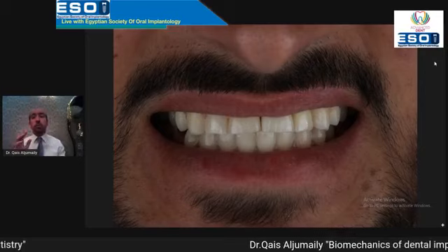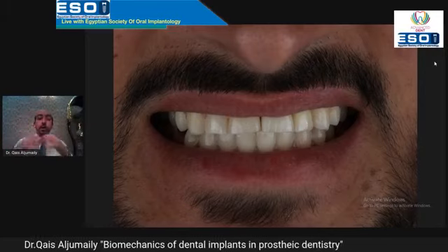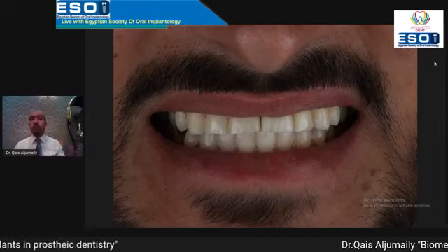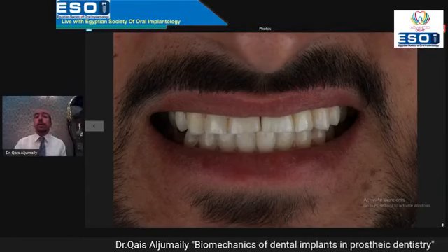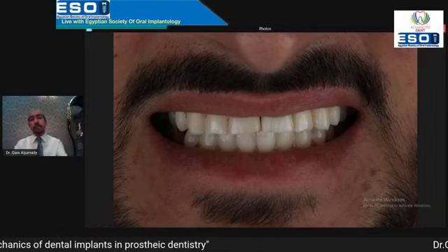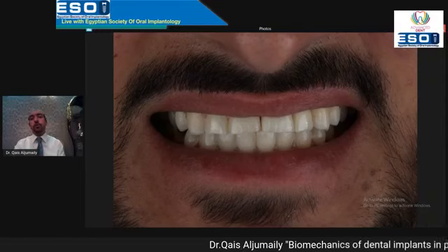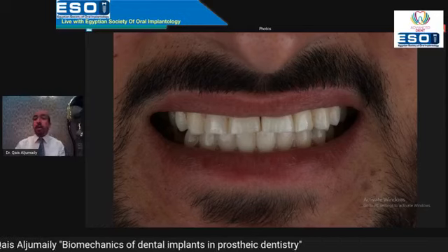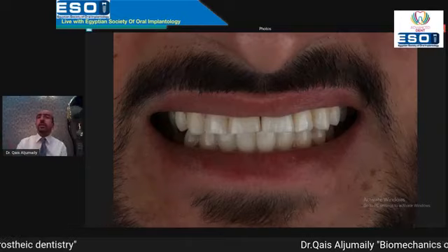So please don't think immediately about the surgical part or the periodontal part. Try to make a study model, photography, try to study the case from all points of view, then put your treatment plan. Here, the orthodontic treatment took about 8 months, and then the implant surgery, waiting 4 months more for complete osseointegration, and then we did the prosthesis. It takes time, and maybe somewhat costly, but the final result will be perfect, especially since he's a very young guy.